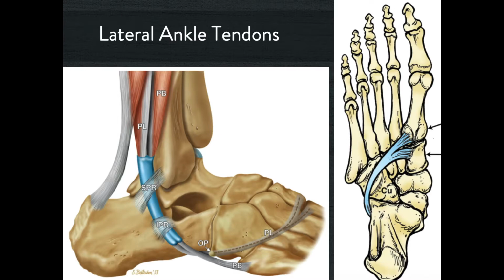Another thing on the lateral side of the ankle I want to touch on is the peroneal tendons, because when I look at the peroneal tendons, I don't like to think in terms of simple peroneal tenosynovitis. I think there's always a cause for peroneal tenosynovitis, and I think the cause is quite predictable. If Peroneus brevis is involved, this is implicated because Peroneus longus gives a compressive injury to Peroneus brevis as it goes around that lateral malleolus deep to the superior peroneal retinaculum in this area here.